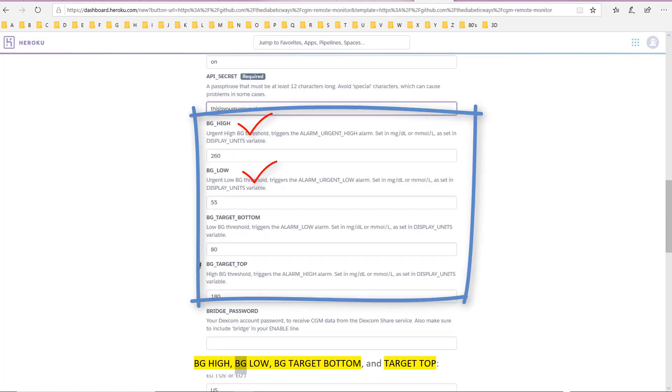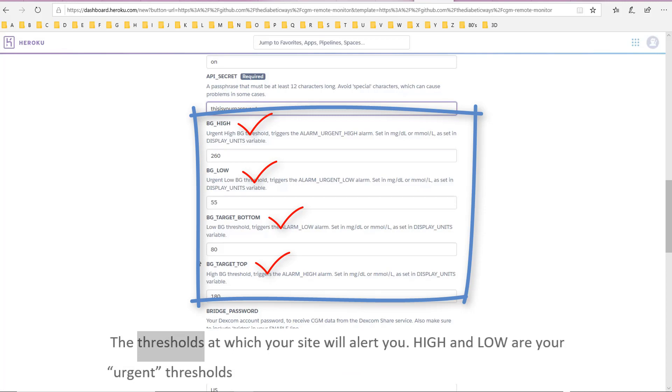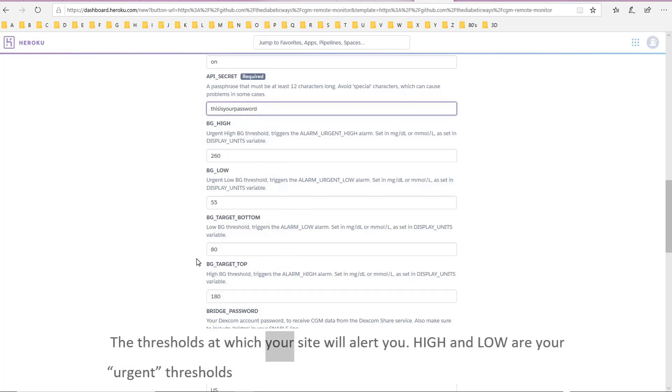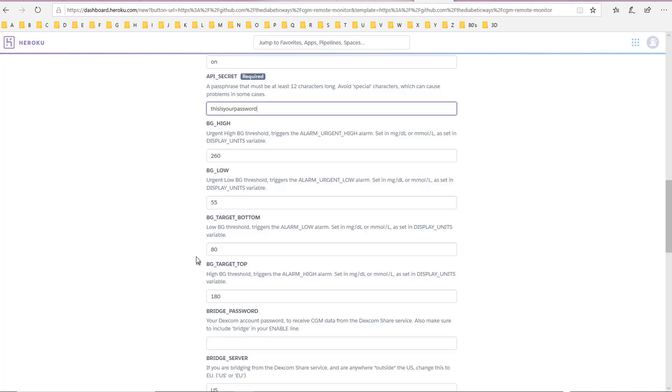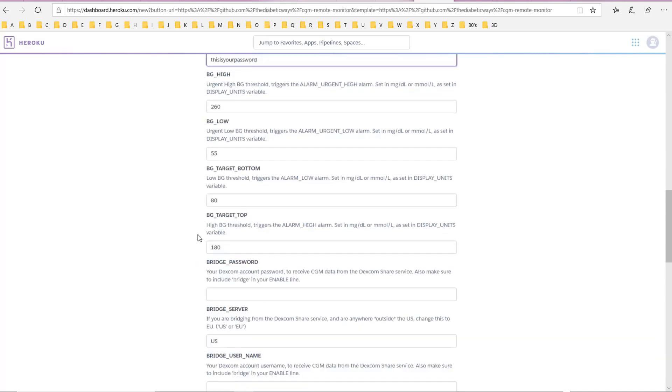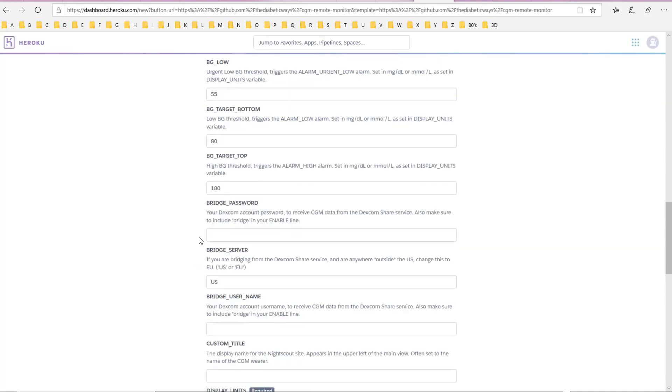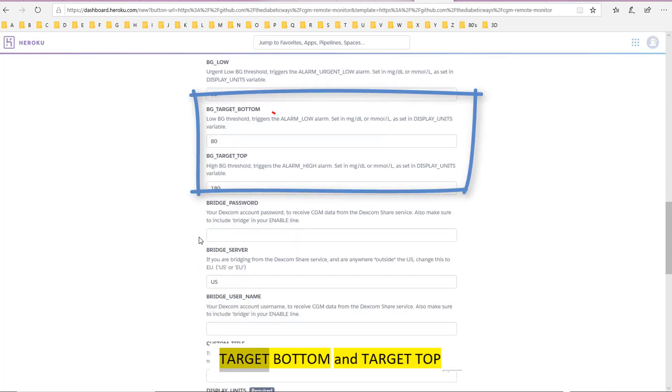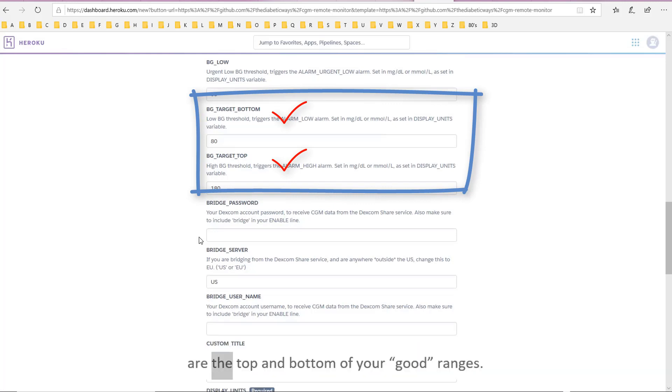BG high, BG low, BG target bottom, and target top: the thresholds at which your site will alert you. High and low are your urgent thresholds. Target bottom and target top are the top and bottom of your good ranges.